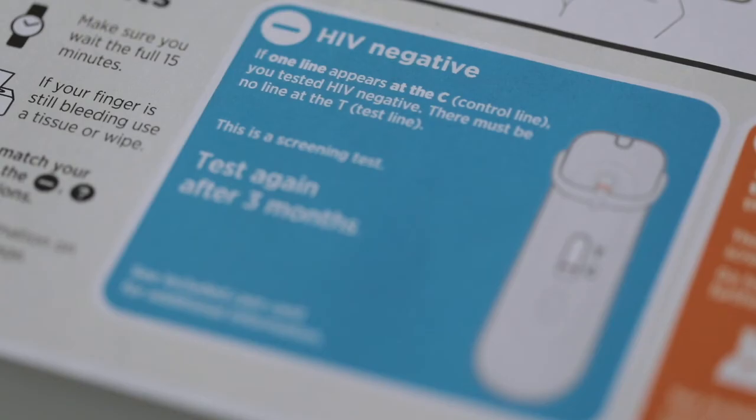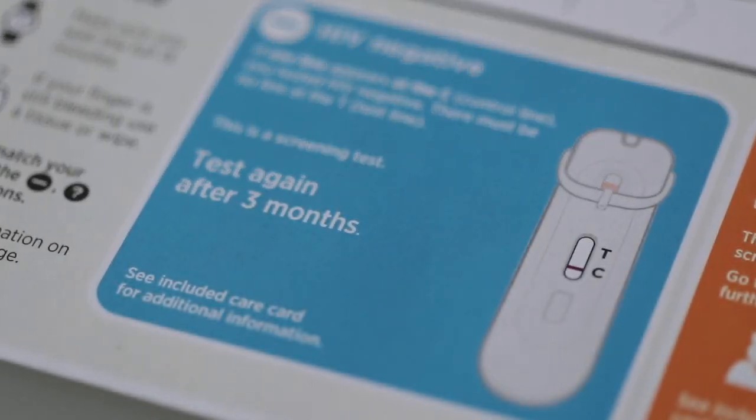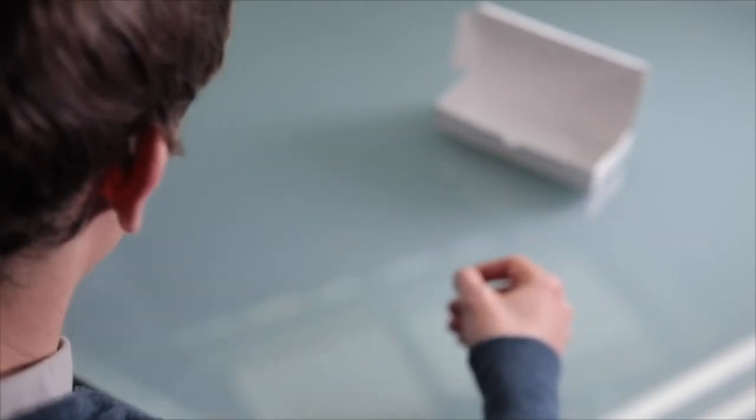Look in the blue box called HIV negative. If a line appears next to the C but no line appears next to the T, you have tested HIV negative. You should test again in three months' time. More information about HIV can be found on the back of the instructions.